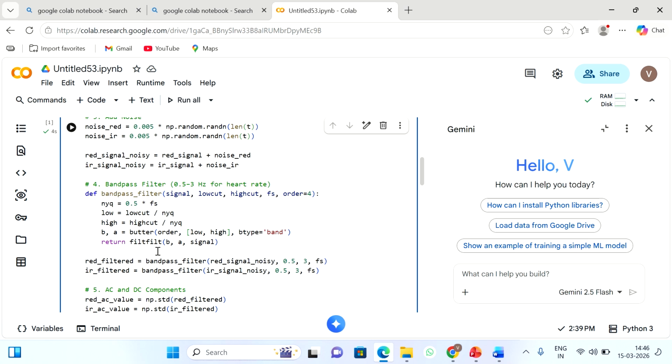Why do we apply the filtfilt function? It applies the filter with zero phase distortion and gives a cleaner output. And then 0.5 hertz, already given here. 0.5 hertz means 30 beats per minute, that is 0.5 into 60. In the same way, 3 hertz means 3 into 60, 180 beats per minute. So only heart related frequencies are passed. That is why we choose the lower cutoff frequency and higher cutoff frequency.